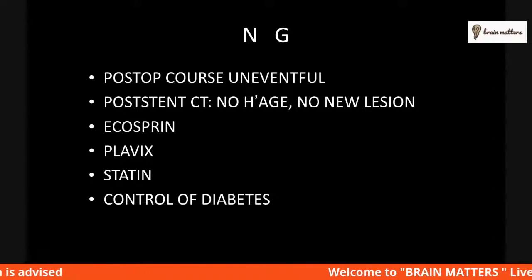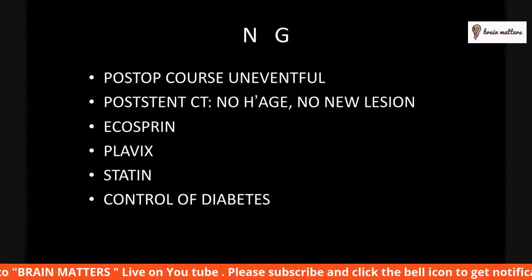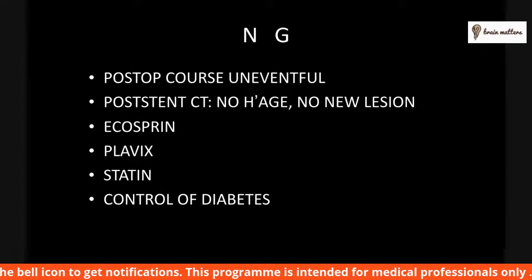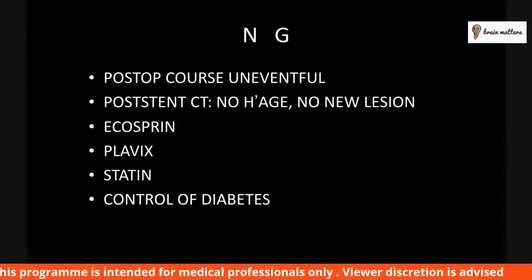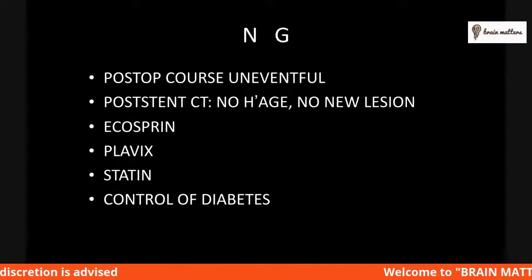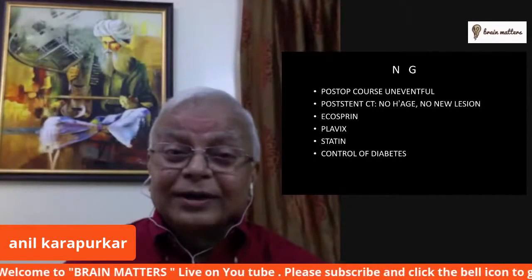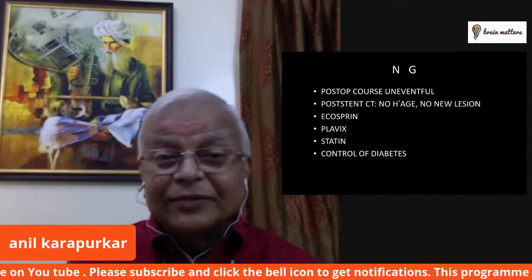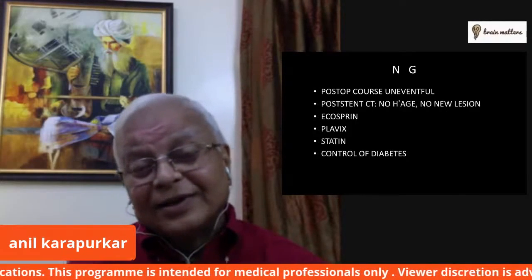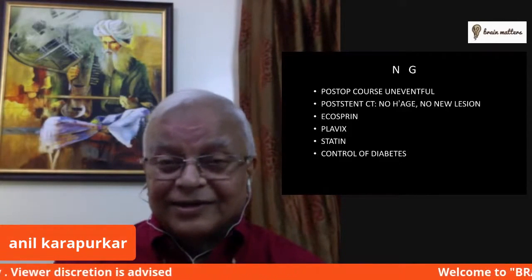I don't know whether you guys know Iyengar. Iyengar was one of the leading yoga exponents and teachers in Pune. So in fact, he went and learned how to live his life after Parkinsonism. 15 years after the stenting, he was doing very well. So this was with a drug-coated stent. What was unusual was the right M1 was totally occluded, and he never had any symptoms pertaining to the left side of the body. What he had come with, obviously, was ischemia in the left hemisphere with TIAs of hand and face.